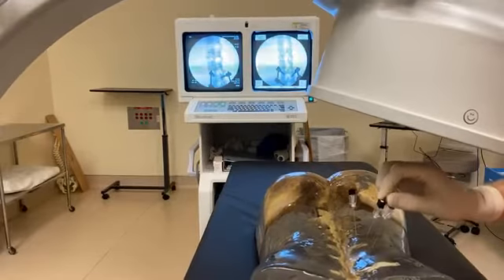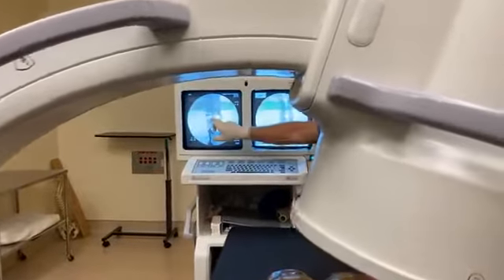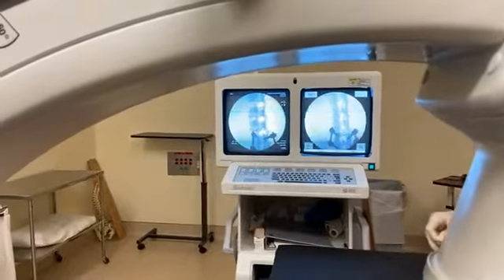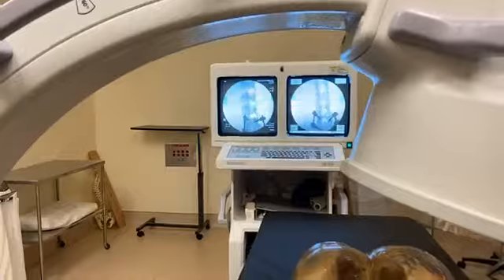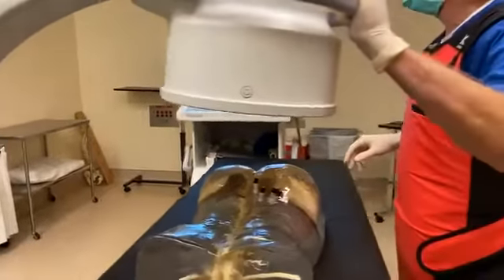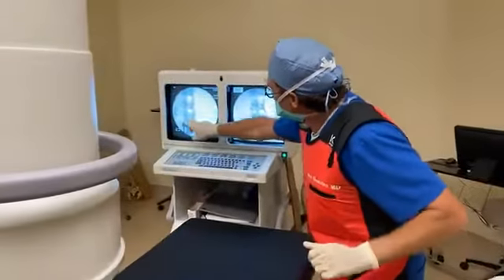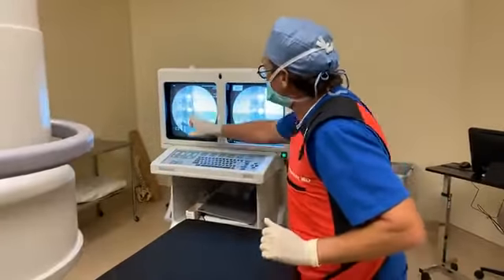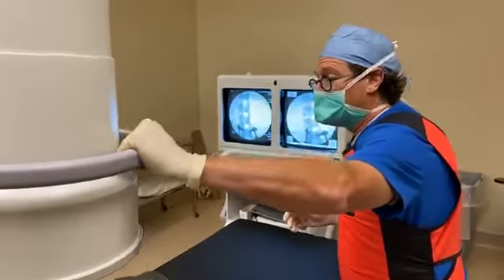Okay? So there is a nerve there. This nerve here and this nerve here innervate that joint. Save that, put it on the right. Now let's roll back to you. Good deal. So you see a needle in the joint here. That's the needle in the facet joint. You no longer see the facet joint because this is a different view.